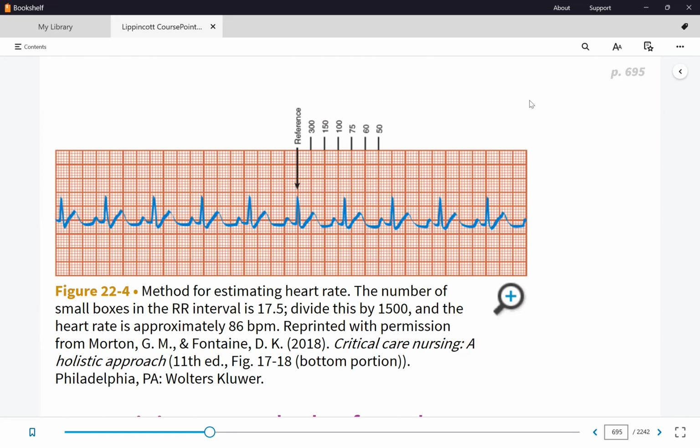So the T wave stops here. However, can I move it? Yes, because technically my marker started here, but this heartbeat started here. So if I move this, then this would have been within my 6 seconds. Okay, so that's 8. So it's the same, 80 to 90.